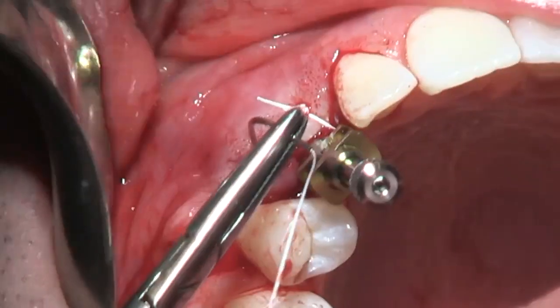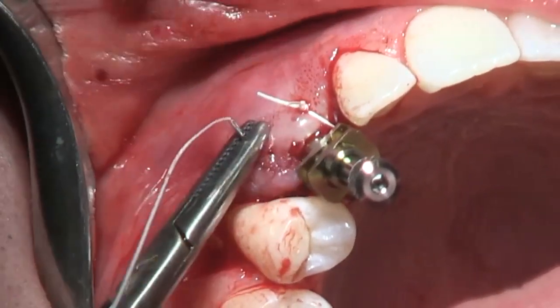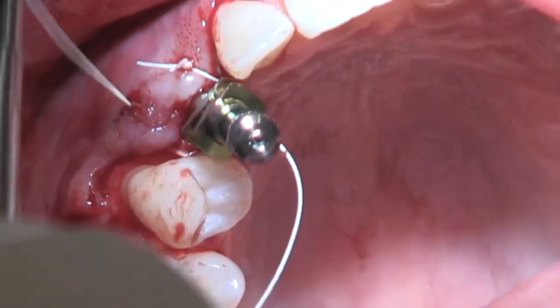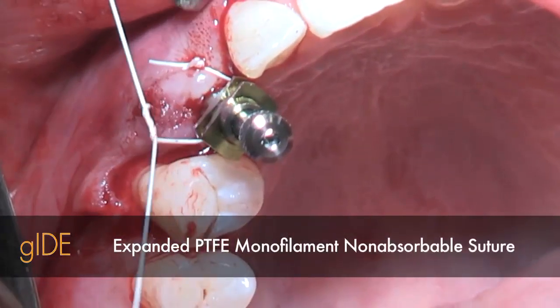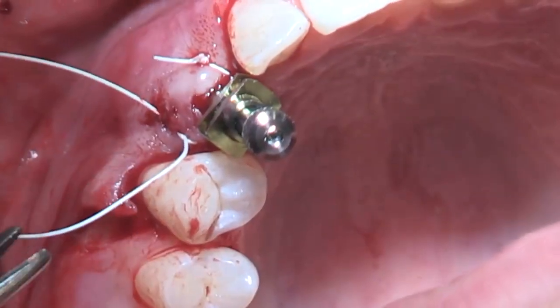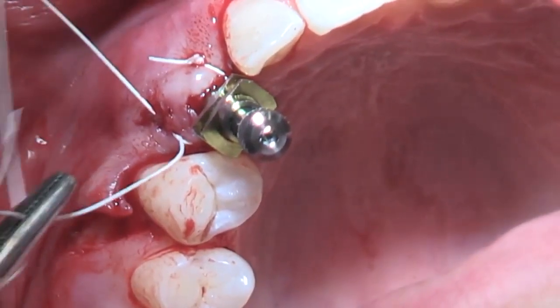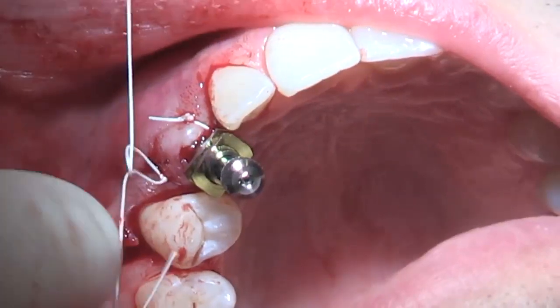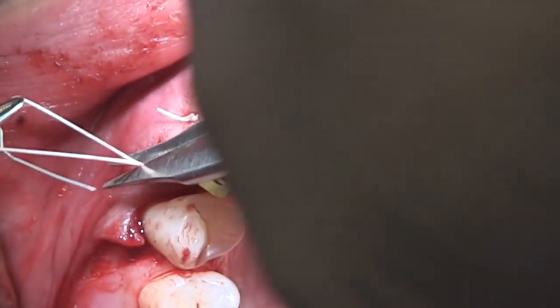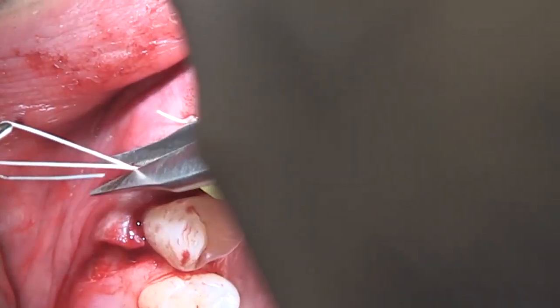soft tissue margin. The suture material utilized here is an expanded PTFE, and as you can see, the placement of these sutures places the flap very close in approximation of the impression coping.